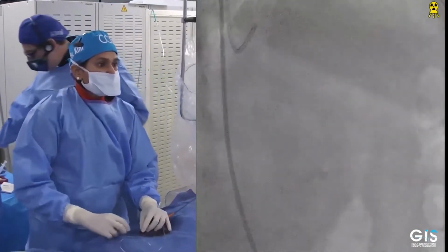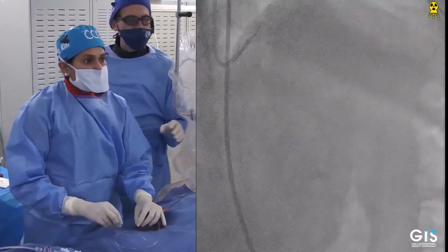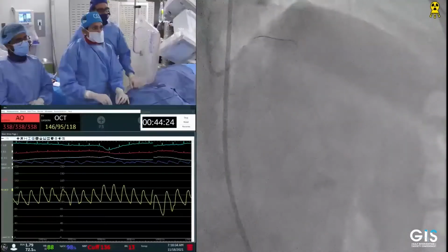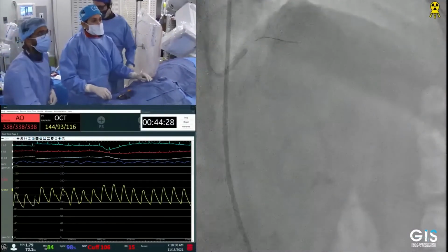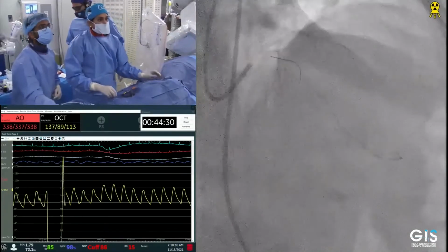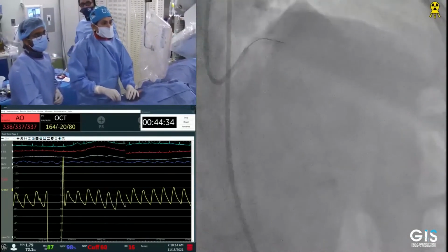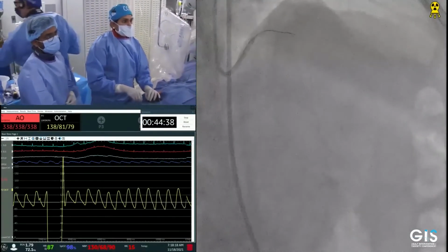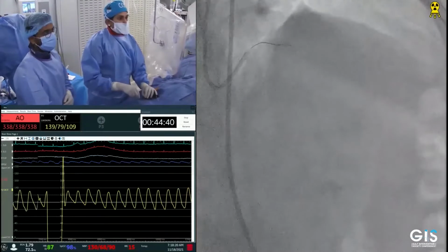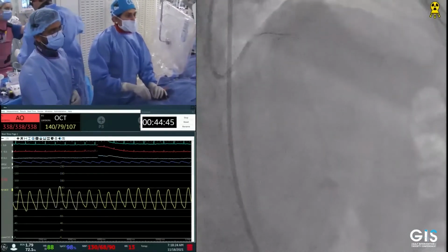Perhaps while we're wiring and setting up the OCT, we can have some panel discussion from your point of view. Thank you very much. I have here with me Dr. Muhammad Subhi, Professor of Cardiology, and Dr. Abdullah, Dr. Jassim, Dr. Ahmed. So please, any one of you, you've seen the angiogram. Tell him what you think of the lesion. Is it for PCI?